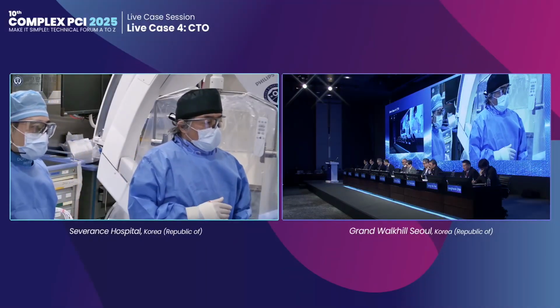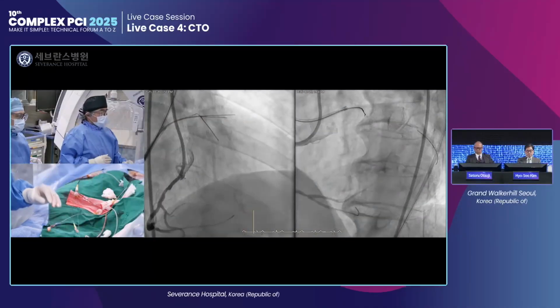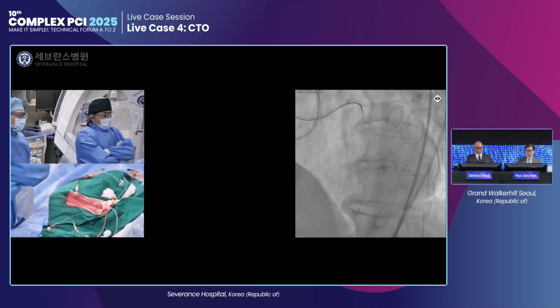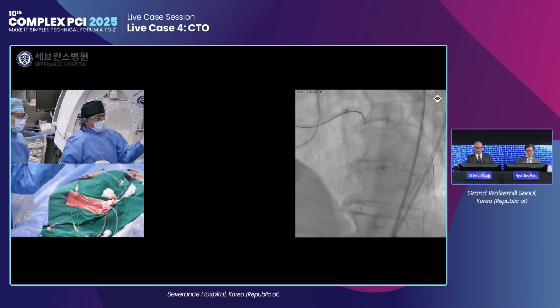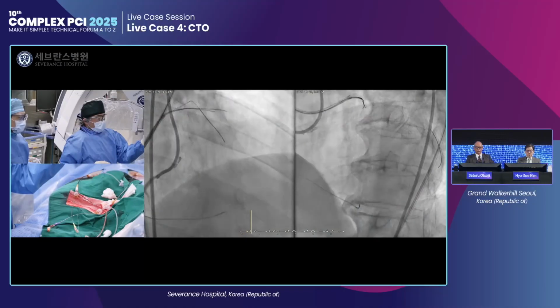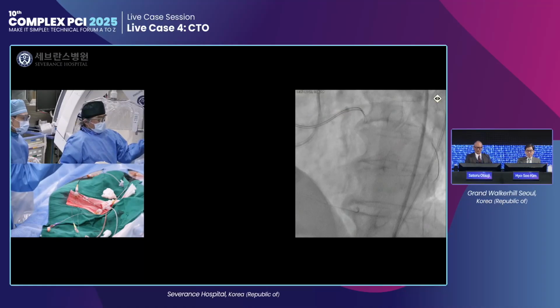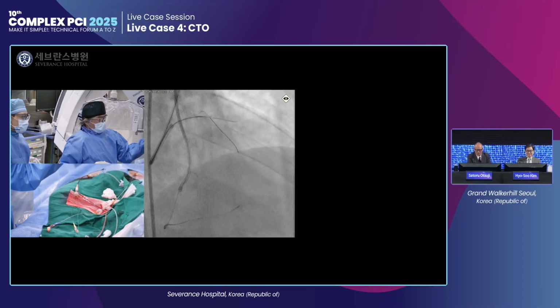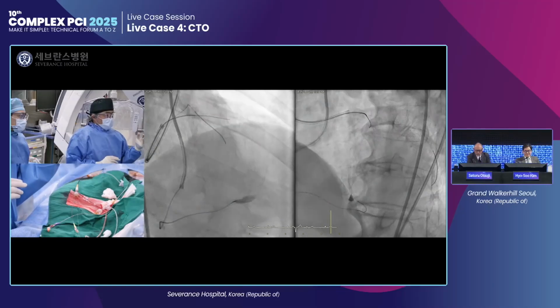Okay. So from the minus one, minus. Okay. Also, this is the first wire.